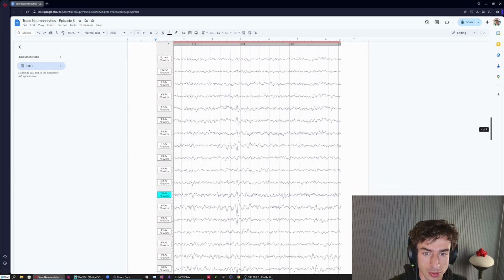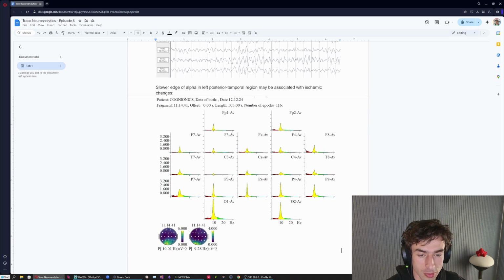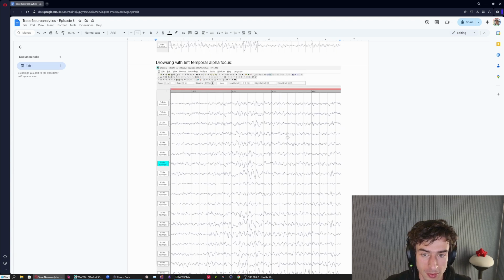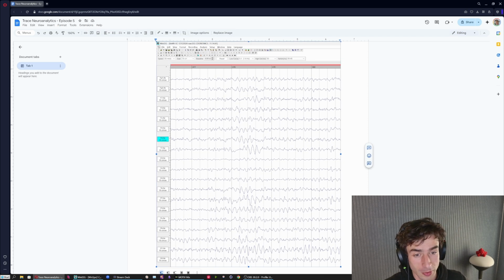So those are my initial thoughts on this EEG. Again, I don't really have any other clinical or personal background information on this particular subject. So I will refrain from offering any further commentary or suggestions other than that this is a great recording. And it looks like there were good impedances all around, and that this is a promising first start in recording high-quality EEG.